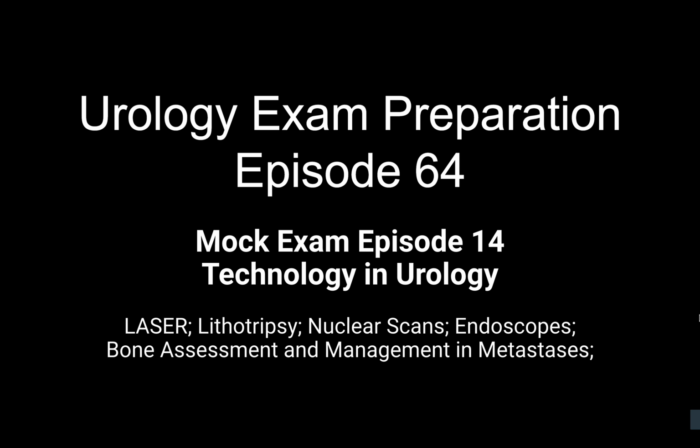And you should be able to give a little bit more information on how you are going to use single-use flexible ureteroscopes in practice. This is more of a management question, but as you know, in technology you can get some management-related questions. So for example, if you have single-use digital cystoscopes, you can use them in the clinic to remove the JJ stent. The patient attends the clinic for review, and the check X-ray is normal.